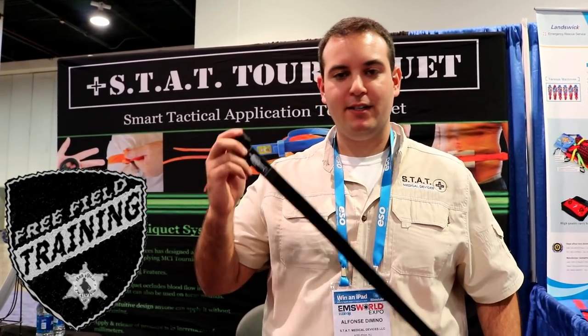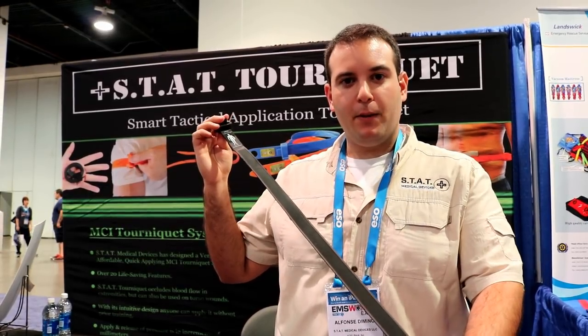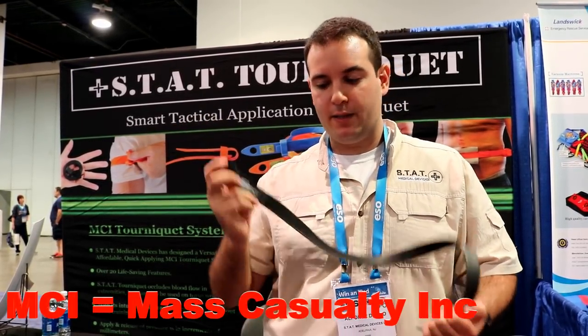Hi, my name is Al from STAT Medical Devices. This is the STAT Tourniquet. As you can see, it's based off of a zip-tie platform. Being used in an MCI situation, people have a little bit more familiarity with this type of design.